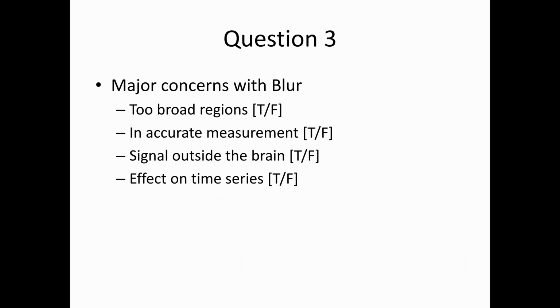Signal outside of a brain? Not really. You mask your data. Signal outside your brain is going to be accounted for there. You won't get too much false signal intruding from outside the brain into your imaging data unless you left your pager in there or something like that. And it wouldn't be locked to the stimulus, right? Yeah. So then it would probably average out. You can have distortions and concerns like that potentially with sinuses and so on.